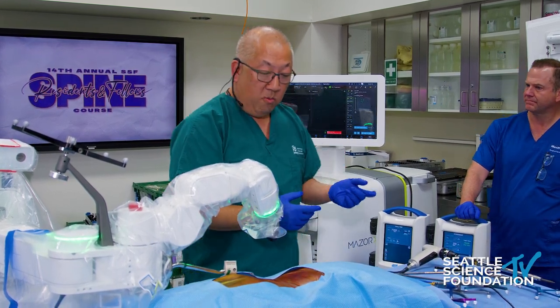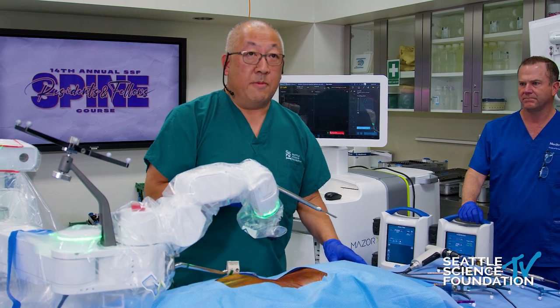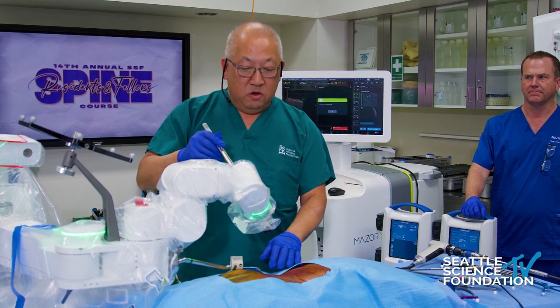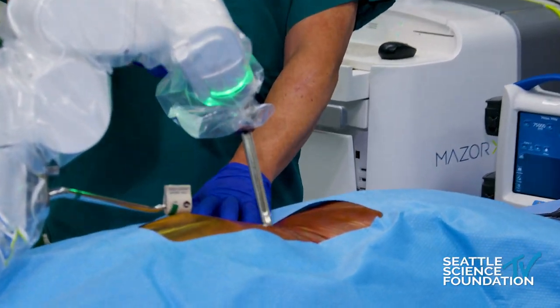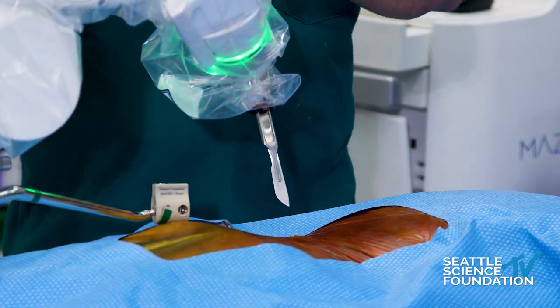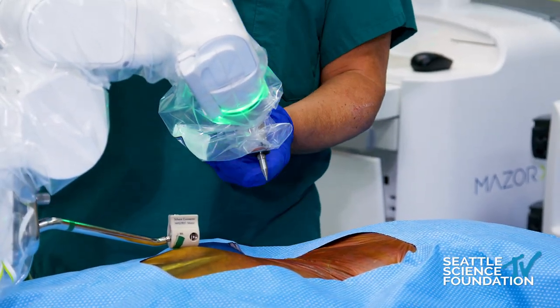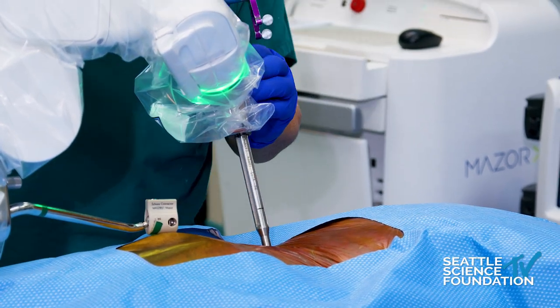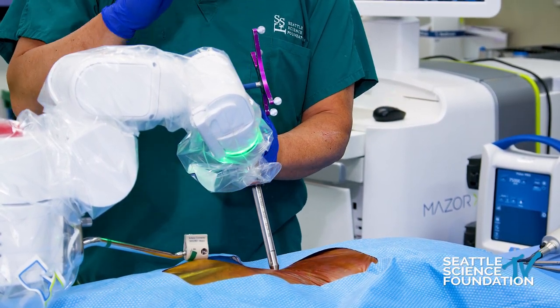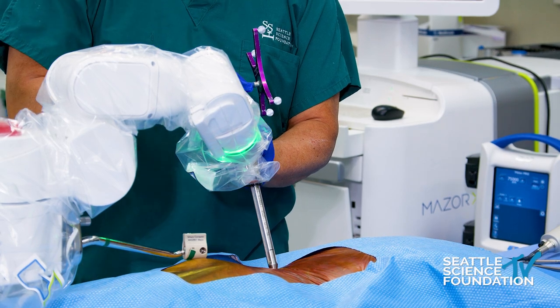We're going to send the robot to the left L3 pedicle screw position. For this demo we'll really demo a MIS perc technique — obviously you can do this open or mini-open. The robotic arm has moved. I'm simply going to make a small incision with a 22 blade down through the fascia and down to the spine. Then I take my navigated dilator and cannula going right down the rigid arm. There was a comment about losing tactile feel, and it is absolutely true you lose some tactile feel working through a rigid arm with heavy instruments — but I would argue that tactile feel will be superseded by the computer planning, the accuracy, and the predictability of the robot.